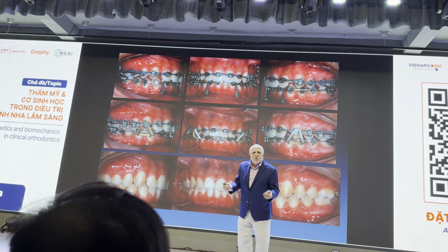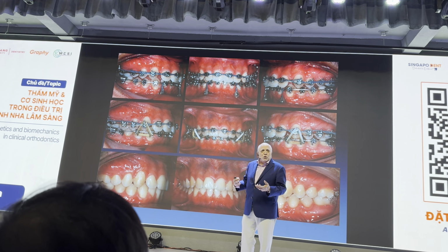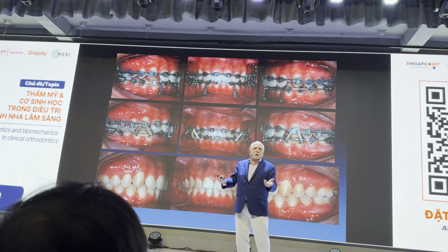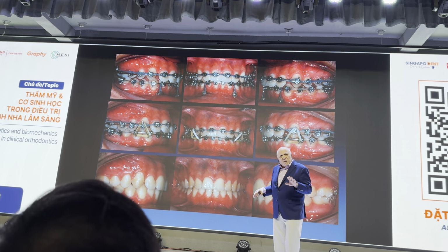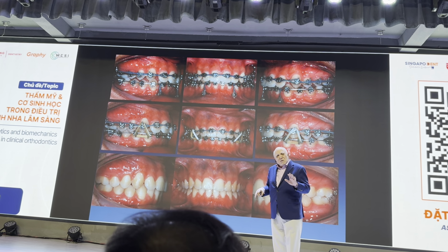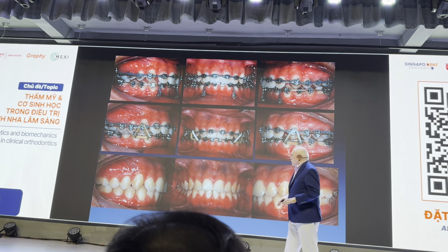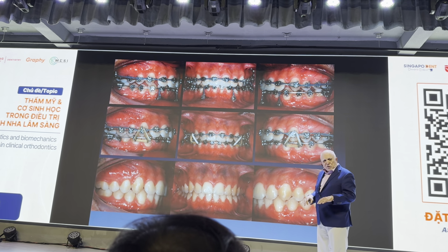I can do much easier because we tried this thing, and I always show this to tell that the intrusion wire or cantilever can do a much better job than putting a tag to intrude. If you are using aligners, it's a different story because aligners usually do not effectively intrude the teeth. They do not effectively intrude the teeth because it's very difficult to control the long axis of the teeth.